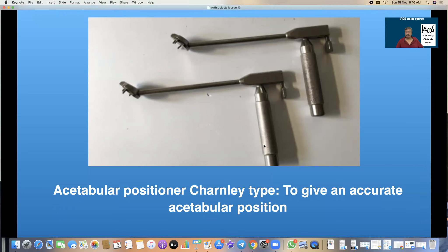By moving this up and down we can control the anteversion or retroversion of the acetabular cup.